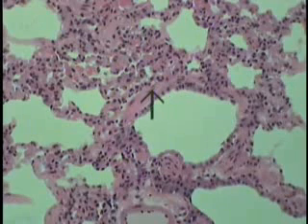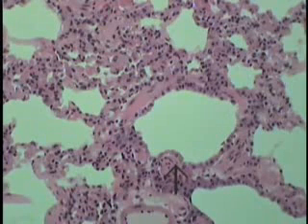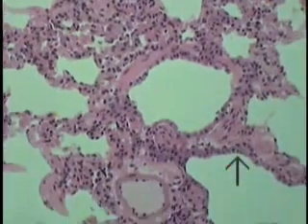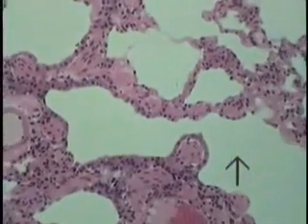You can see as the arrow indicates, as it spirals around the lumen, it then starts to form a more open spiral. We're missing a bit here. Here the smooth muscle musculature is cut in cross section, and then continues in this direction. This terminal bronchiole rapidly gives rise to the first portion of the respiratory system.